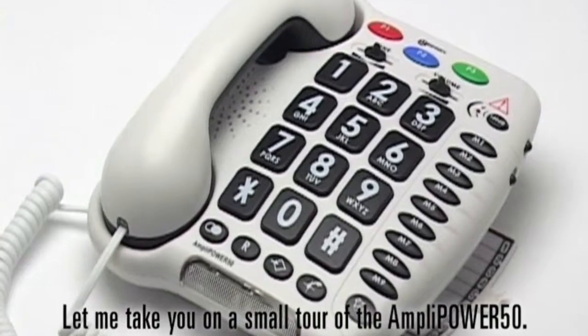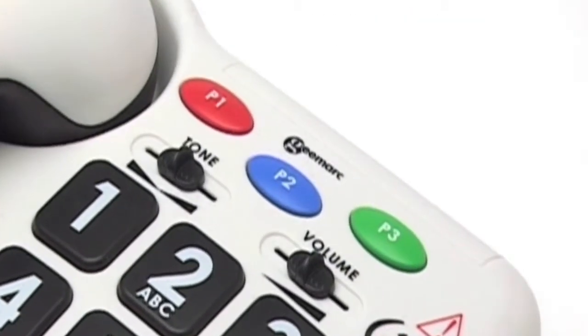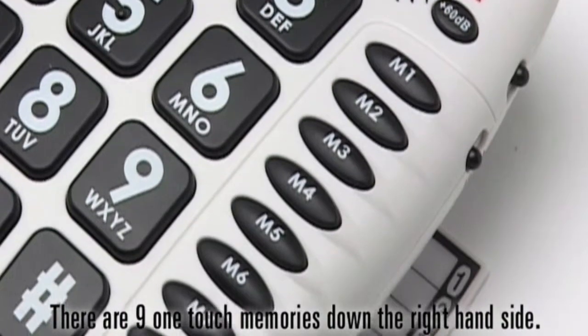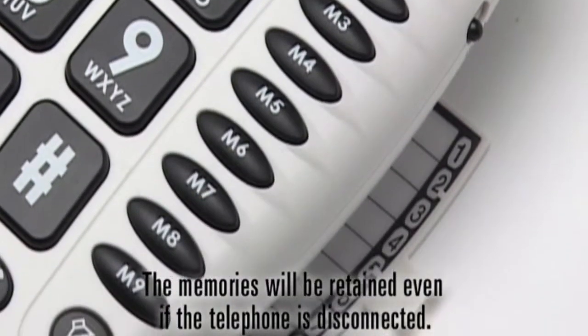Let me take you on a small tour of the AmpliPower 50. At the top we have three emergency dial buttons. You can program these buttons with the emergency number of your choice. There are nine one-touch memories down the right-hand side. The memories will be retained even if the telephone is disconnected.